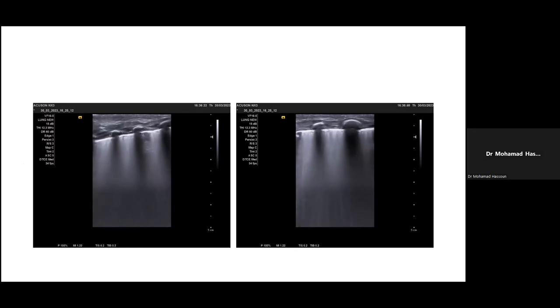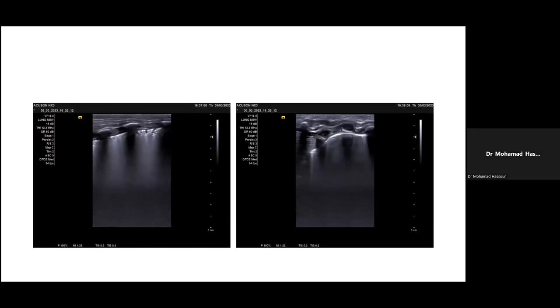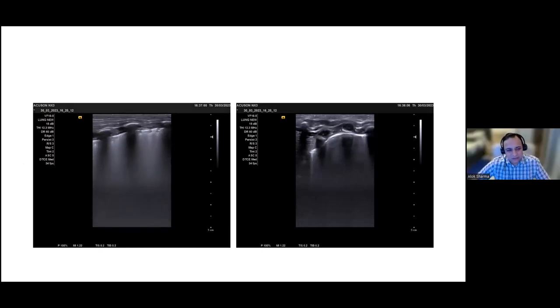So if we look to the R4, also the pleura is good sliding, many subpleural consolidations and mostly B-line, B profile. Yeah, beautiful. Here we'll go to the left side, L1. I think this is snowflake sign, no? It is. What it's classically is you've got subpleural consolidations and you've got microatelectasis from the margin.